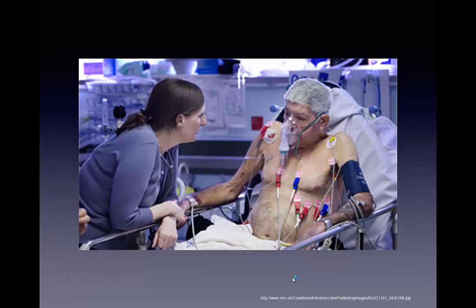We're going to pre-oxygenate him in an upright manner using high-flow nasal oxygen underneath a 100% non-rebreather. In addition, we're going to have a bag valve mask ventilator at the ready. When he is induced, he's going to be ventilated in that manner with a two-handed technique.